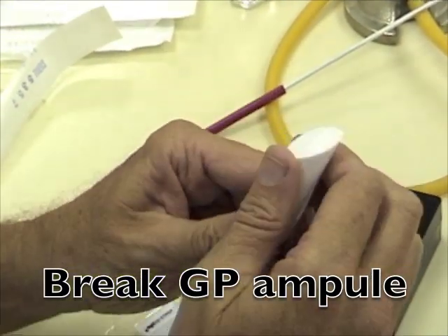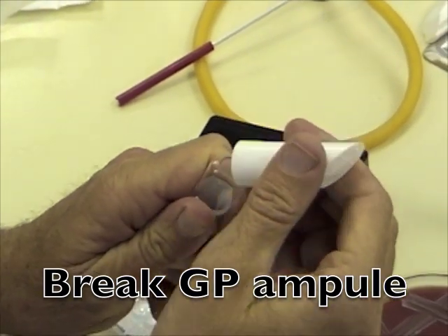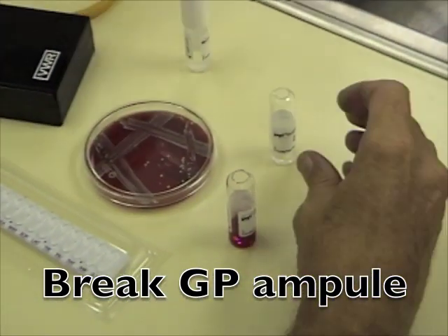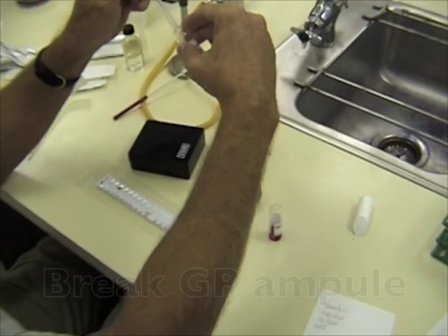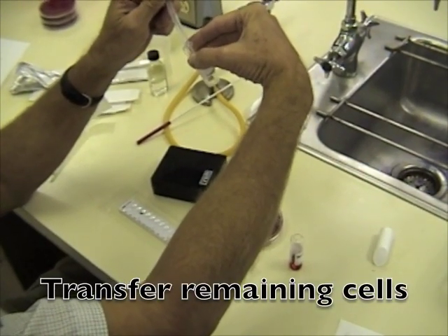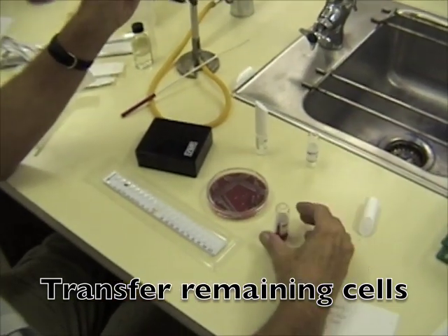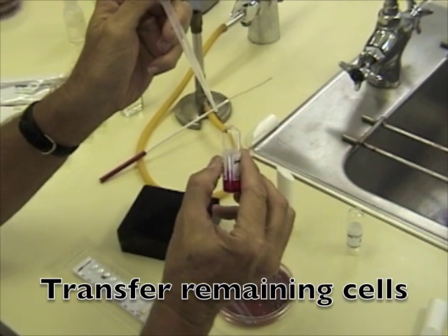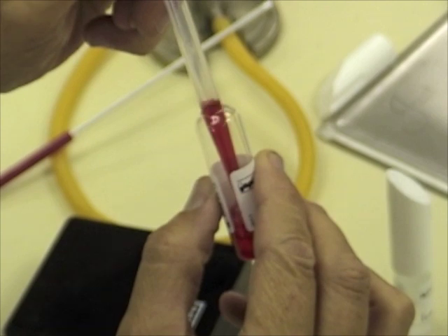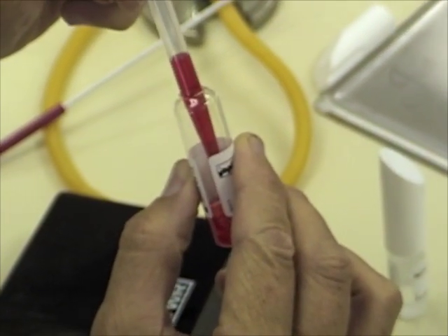In addition to the enzyme tests, there are some growth tests as well. To look at fermentation, which is usually what we're talking about for this growth, you're going to want to take the remaining cells — the entire content left in the vial in dispersion medium — and add it to the GP medium. Mix it around quite well so it's homogeneous, and then add that to the remaining cupules.